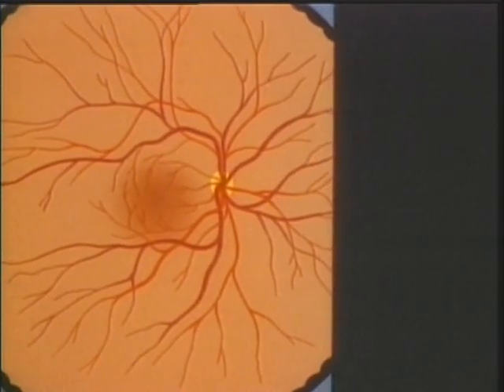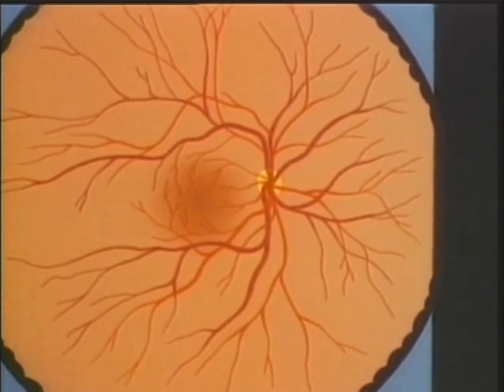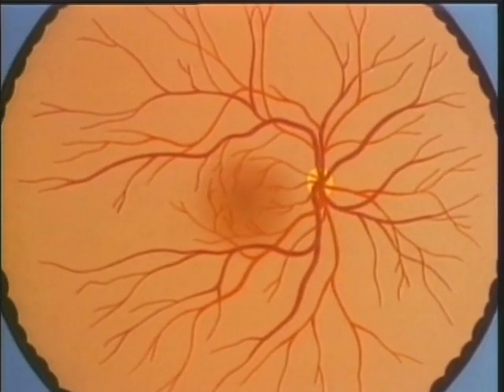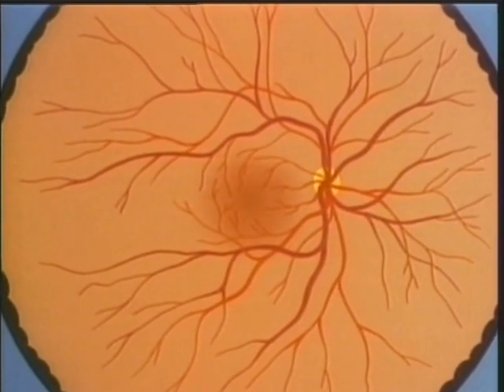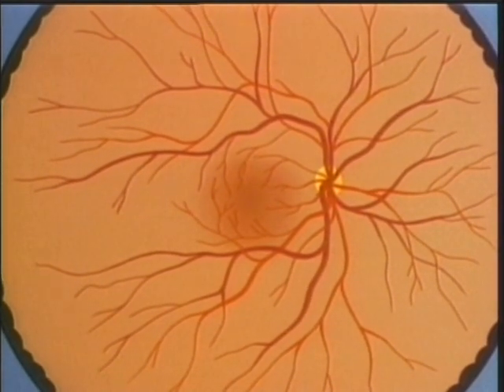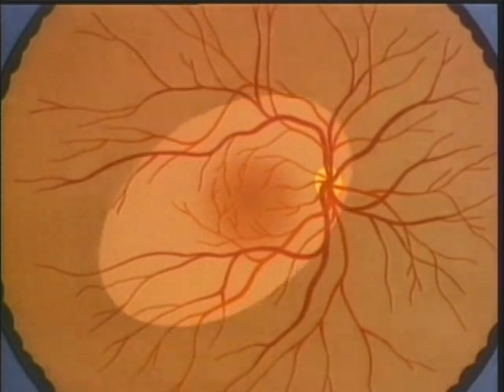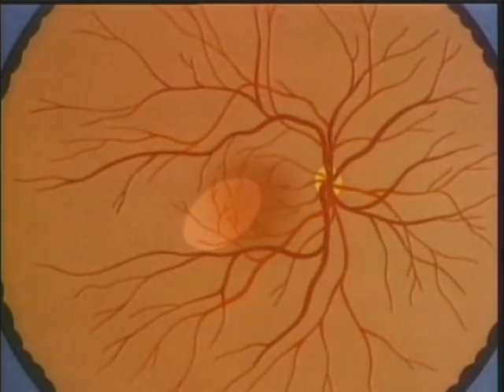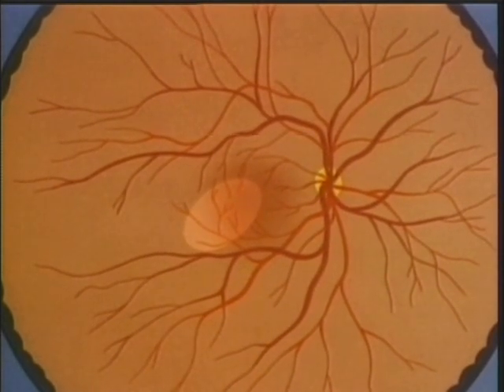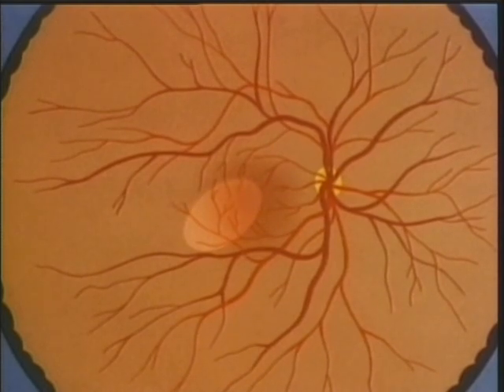The fluorescein angiography examination enables your ophthalmologist to detect the presence of many conditions involving the blood vessels or pigment cells within the retina. In addition, angiography permits localization of the blood vessel abnormalities so that, in some cases, treatment can be performed.